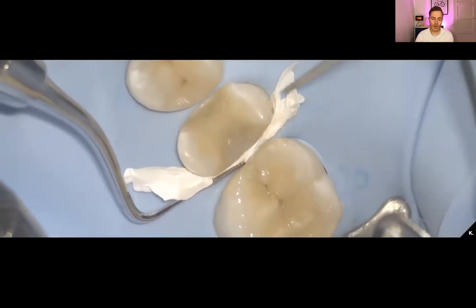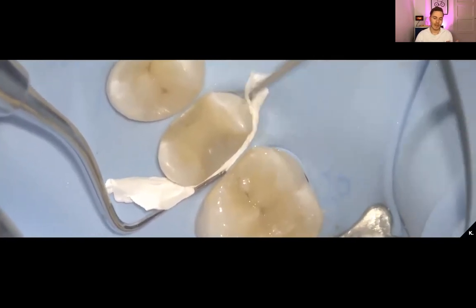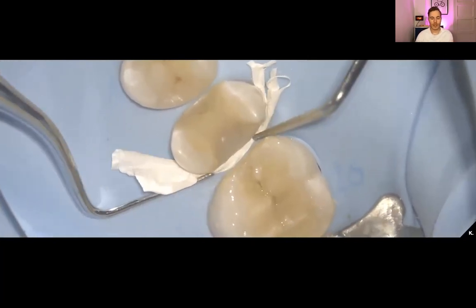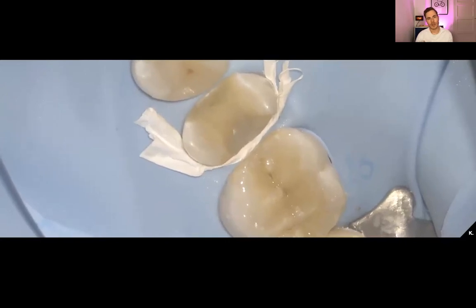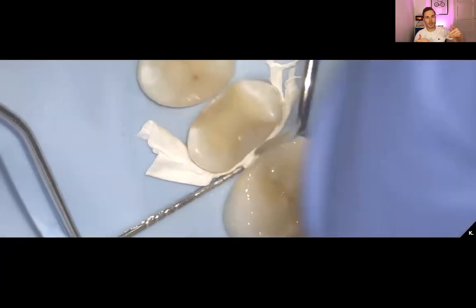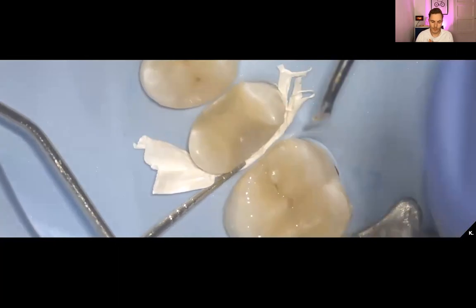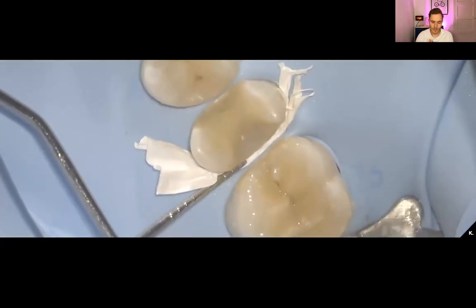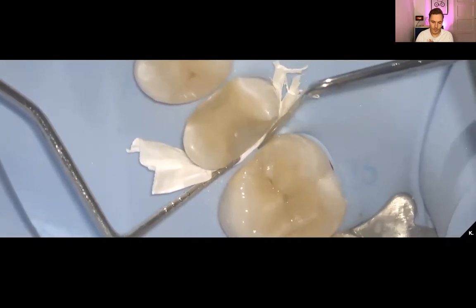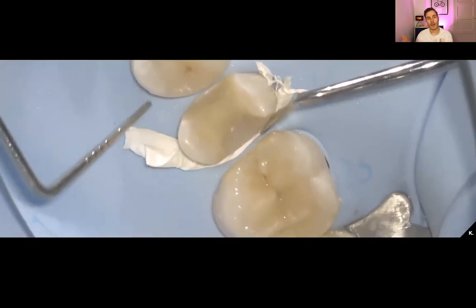I use a flat plastic and a periodontal probe to guide the Teflon apically in between the rubber dam and the tooth. It's pretty hard to apply — you need one instrument to put pressure and then the other instrument to push it down and slide it to the side to make sure that you put it in between the rubber dam and the tooth. I use a sort of swiping motion to make sure that it's packed properly.